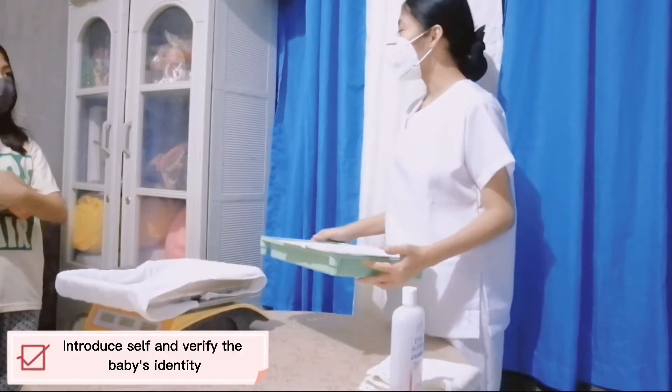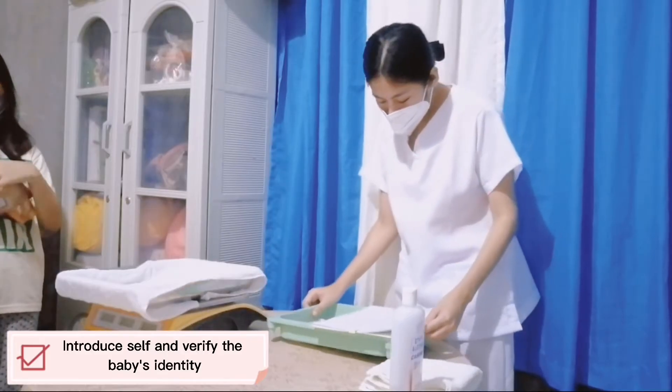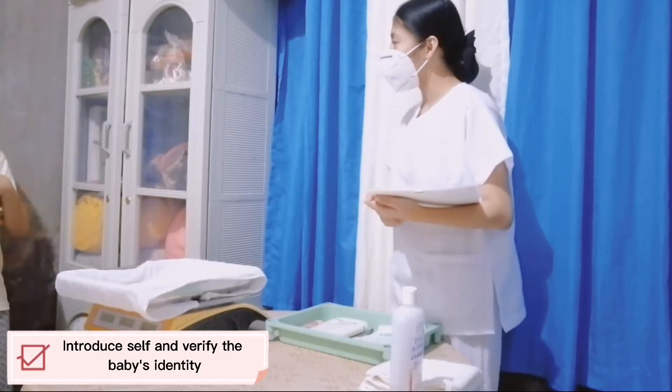Good morning ma'am! I am Damian Tosambal and I will be the nurse for today. Let me first verify the patient's identity. So ma'am, can you please state the baby's name?